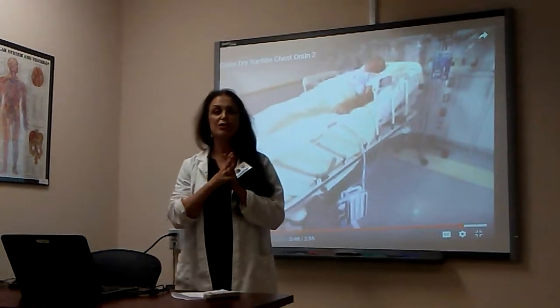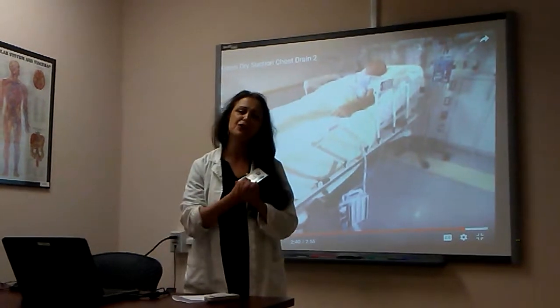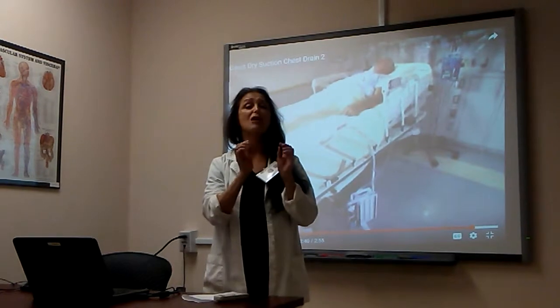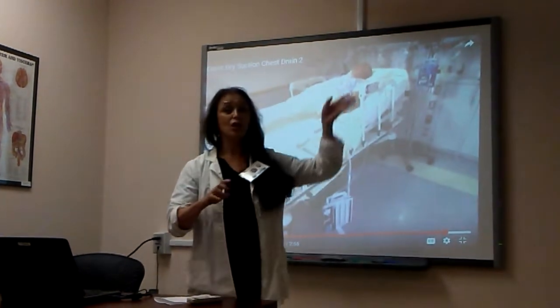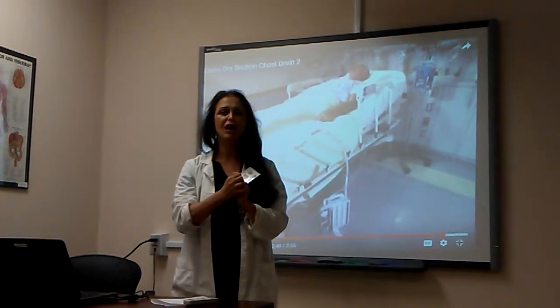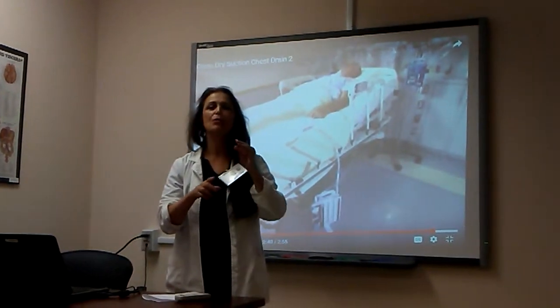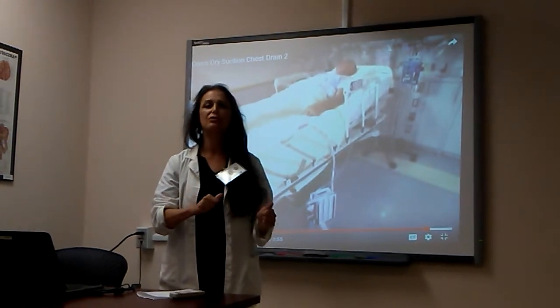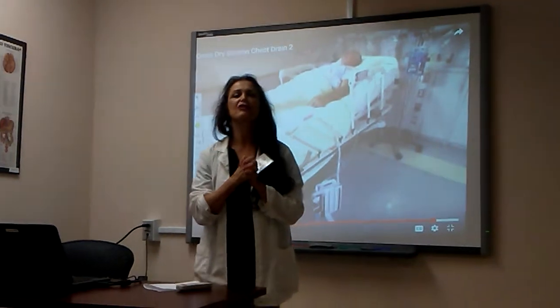It's your observation and understanding of the physiology of this unit and what it's doing, and you're teaching the patient and properly medicating them, as we talked about before, for the lungs to reinflate. It's contingent on the patient also deep breathing. The wall suction and the water seal is not enough. The questions they will ask you: continuous bubbling, problems, okay, leak. The questions they will ask you: rise and fall with breathing is normal in the water seal, or coughing, all right? I think that should cover everything you need for ATI.